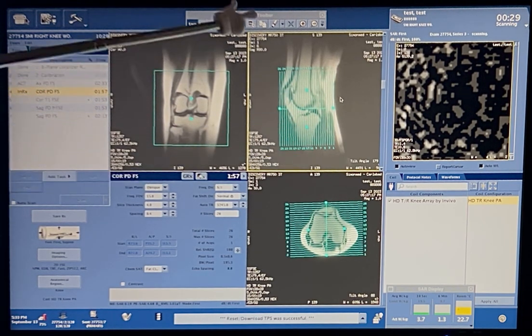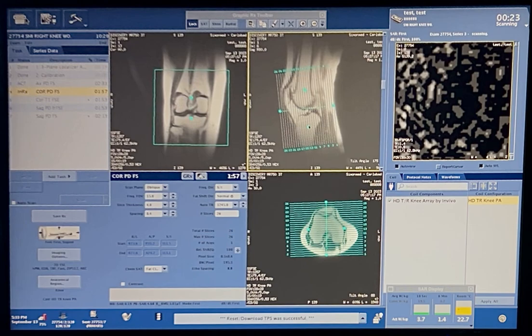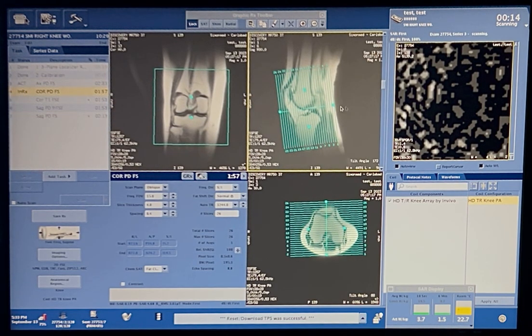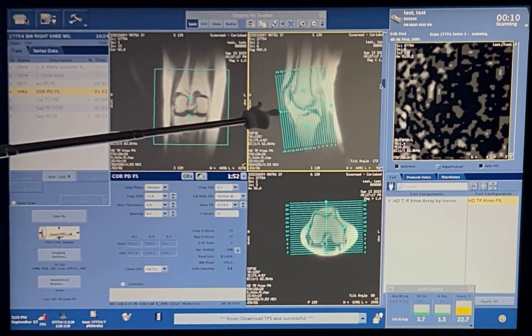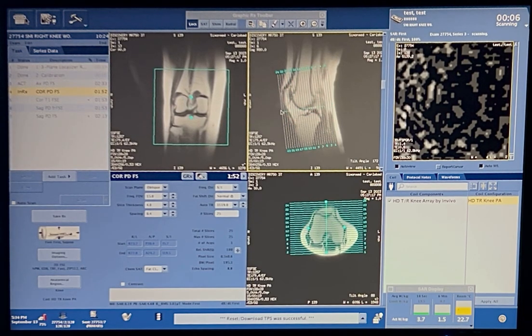Only thing is, you angled the last one pretty significantly, and this one's not angled at all. Okay. So let's angle it a little bit. There you go. And then we could probably cut that one off the back again. Yeah, there you go. Are we getting anything in this front slice? You can cut that one. Yeah, there you go.